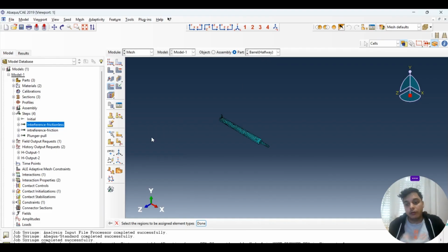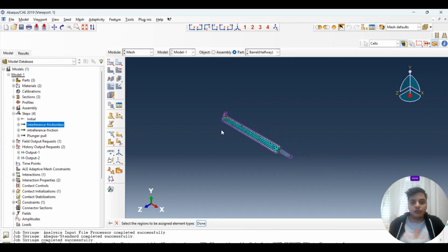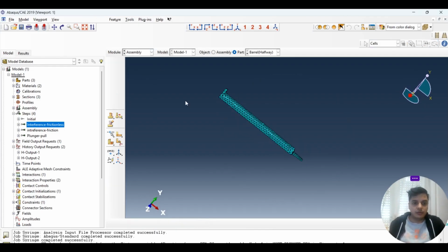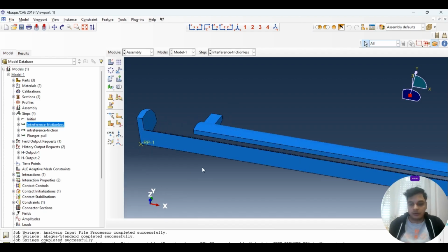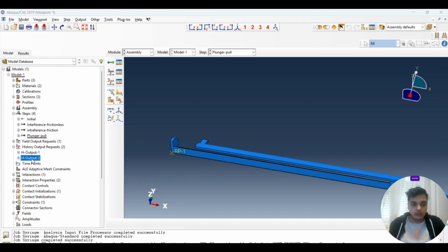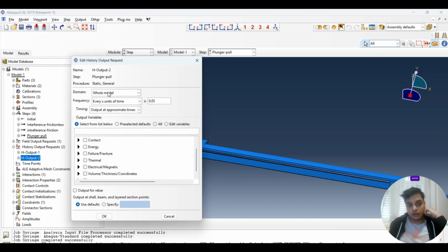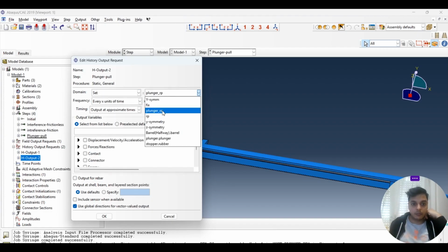Also make sure what exactly we want from this particular analysis, the reaction forces, correct? If we go to the assembly, at the reference point we want the reaction forces, how much force is required to push and pull. So what you have to do is go to the history output. That's what I did here. You define a history output, not for the whole model, which is the default. So just define it for a set. That's where the plunger reference point comes into action.